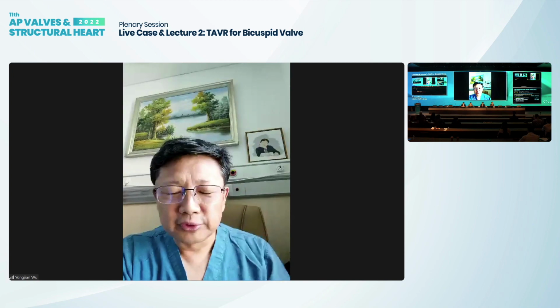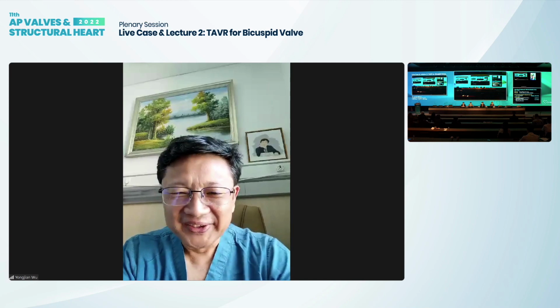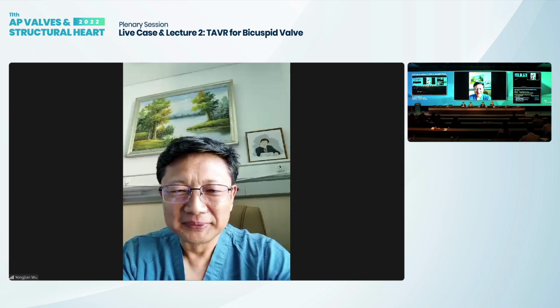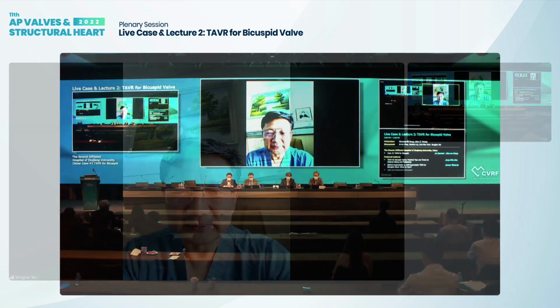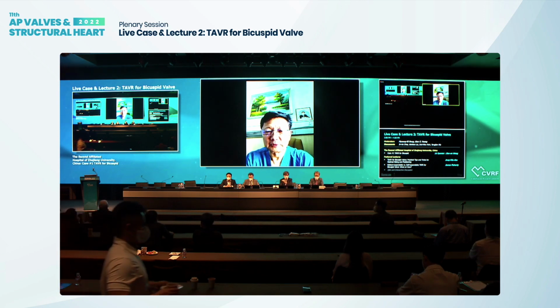I'm Dr. Wu. Hi, Dr. Wu. Yes, hello. How are you? So we got a sheath in, then we did the angiogram. You can see the patient has a stenosis, also with regurgitation. This is the cause of the severe regurgitation. You can see very clearly the calcification is very severe.